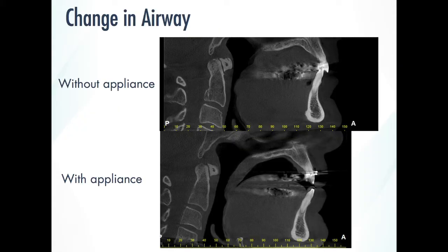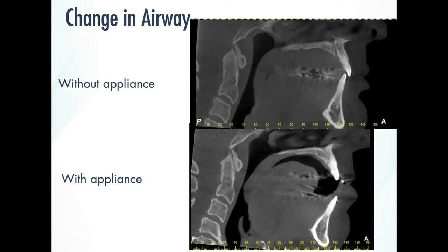Changes in the airways before and after, pretty nice. Before, after, pretty nice. Not so nice. Went backwards. So this is the limitation of the machine. But look at the epiglottis. They're swallowing when they took this picture. So I'm like, take another picture. They're obviously swallowing. So there are limits.